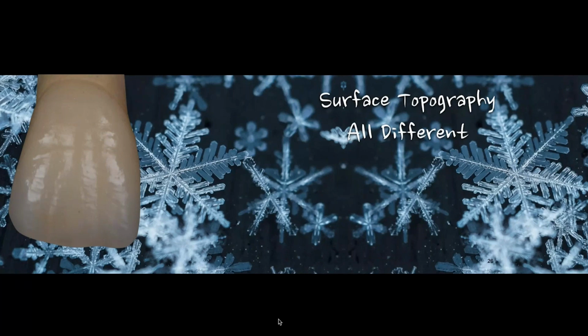Well, there are no two teeth exactly the same. They have similar nuances, similar concepts as far as translucencies and developmental grooves and depth of color. But in the end, no topography is exactly the same as the one next to it or the case you did before. And in our repertoire, we need to work on that to start to understand how to develop that.